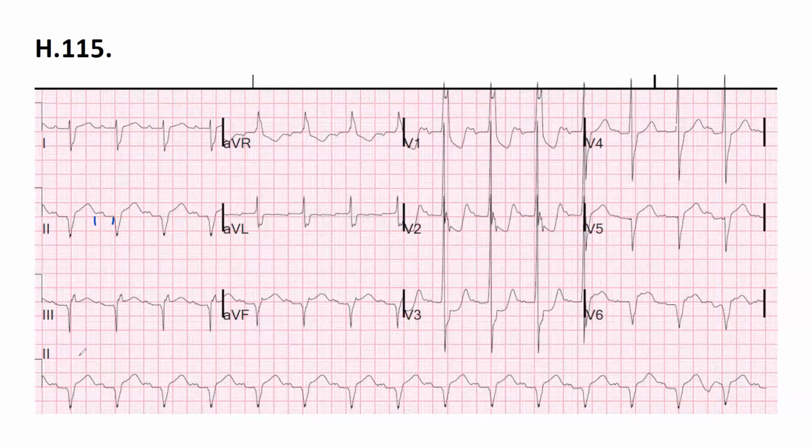Sorry, I couldn't hear just then. What was the question? Okay. We do have a rhythmic heart and PR is longer. Oh, it's a grade 1 AV block. Exactly. All right. Exactly. So that's the first degree AV block.